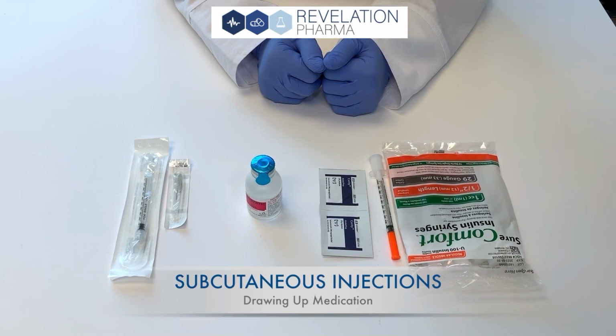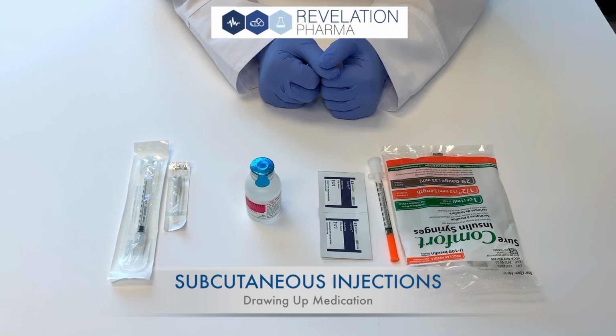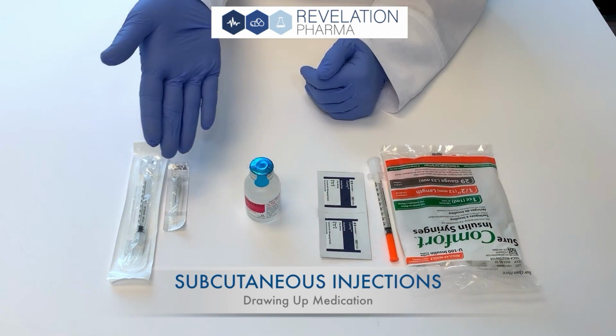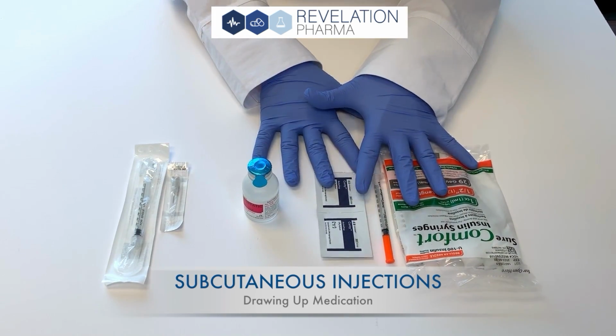A subcutaneous injection, or a sub-Q injection, is a shot given under the skin but not all the way to the muscle. Certain medications need to be given under the skin for them to work correctly. The first step in preparing to give a subcutaneous injection is to make sure you have all your supplies needed and ready. Your kit should contain syringes and alcohol swabs.